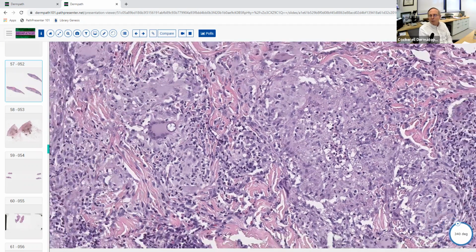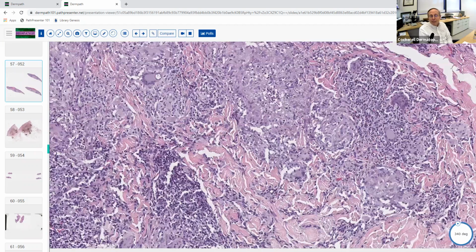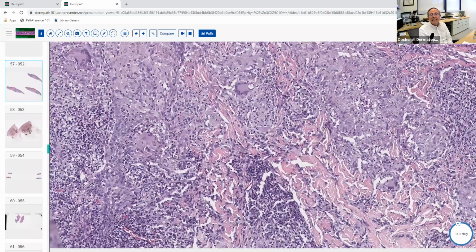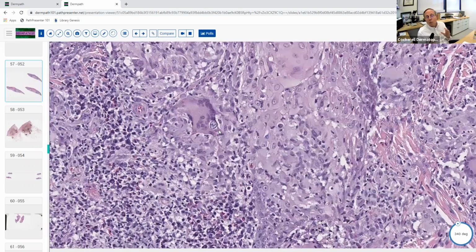So what's the diagnosis that gives you spherules in the skin? Well, by far the most common one that you have to worry about is cocci. And here's another one. So once again, on a board examination situation, they're not going to make you search for the organisms. They're just going to make sure that you can recognize the pattern and then you know where to look and you can identify the organism when you see it.